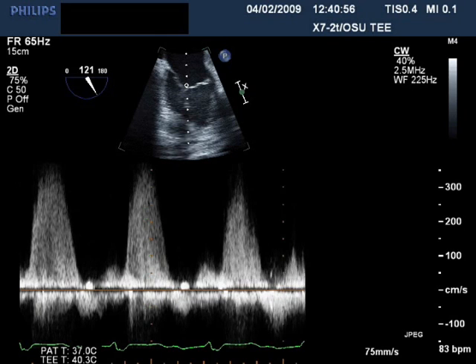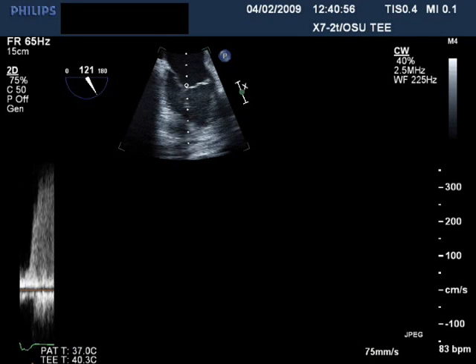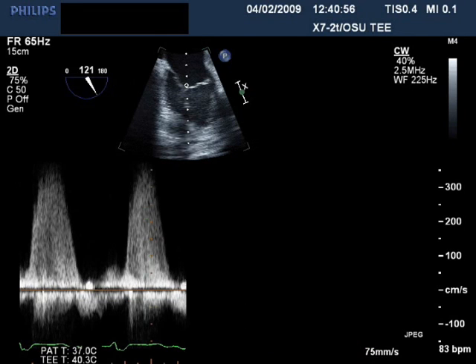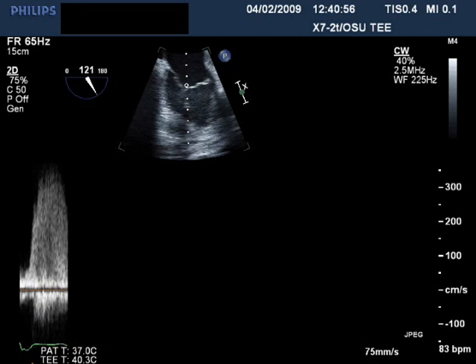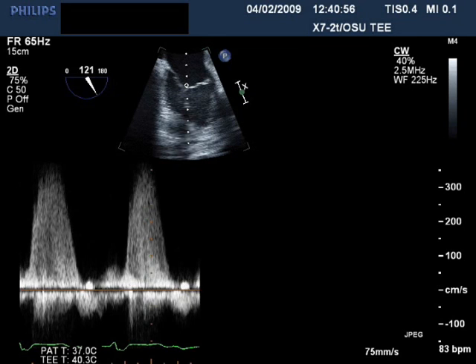This is an example of a continuous Doppler measurement measuring the velocity of blood going through the aortic valve.